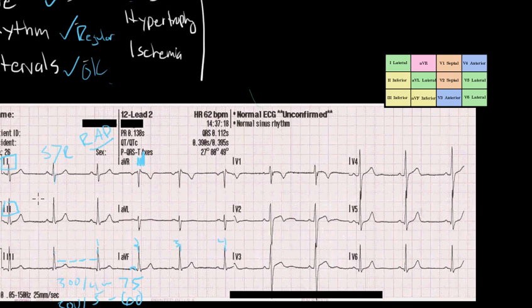However, if in lead two your S is greater than R, that's a sign of left axis deviation. And if in neither leads one or lead two, do you see any findings of S being greater than R, that means you just have a normal axis.